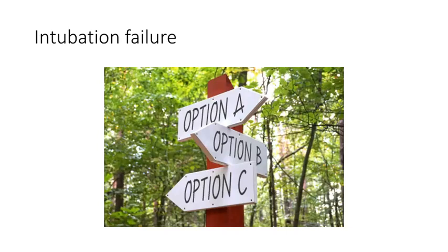Always have a plan for intubation failure. This could be as simple as bagging the patient, could include the use of an iGel, or could be as drastic as a surgical airway. You should be an expert on all of these, so please practice regularly on training dummies so that your skills are fresh. When stressed, you will function at the level of your training. If you don't train regularly, it will be a low bar.